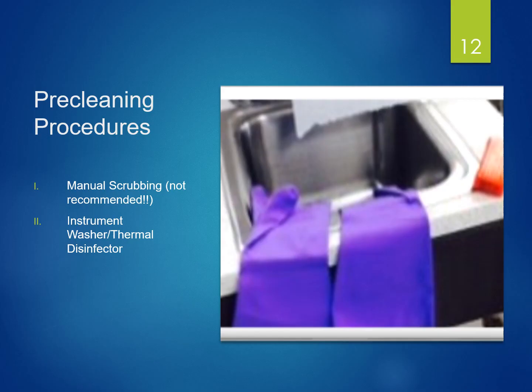In the dental hygiene clinic, you can see in this image these nice pretty purple gloves. These gloves are our utility gloves. We will always use them for handling our contaminated instruments and also taking them in our box to the instrument cart.